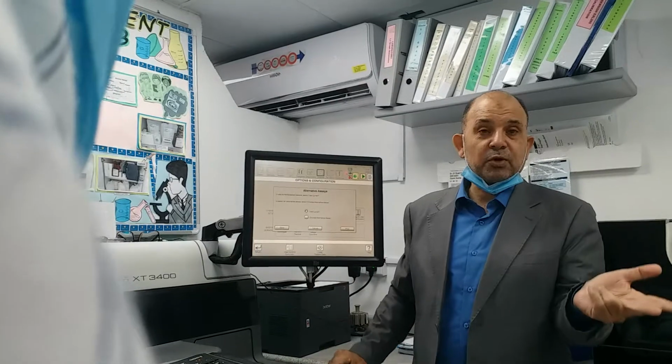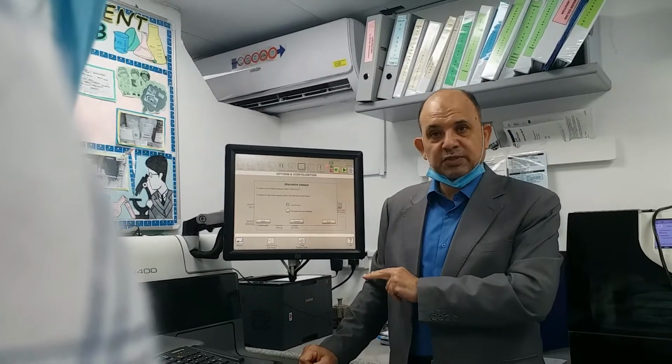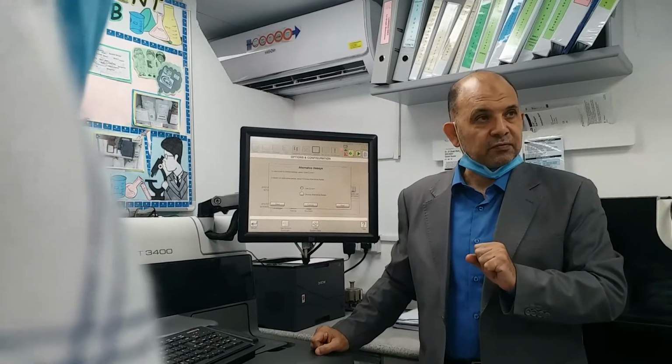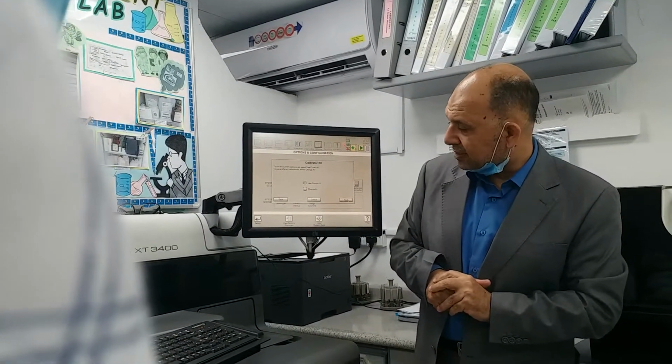But for immunoassay, we have a lot of things. Immunoassay, you don't have it on this machine, you have only chemistry. So because of that, we will use current, not alternative. Okay. Next to that, I'll go to next. Use current or change it.